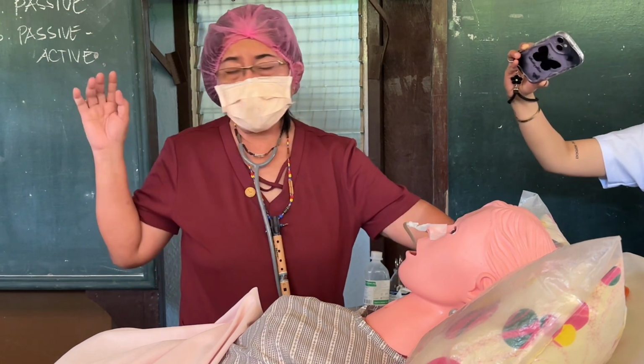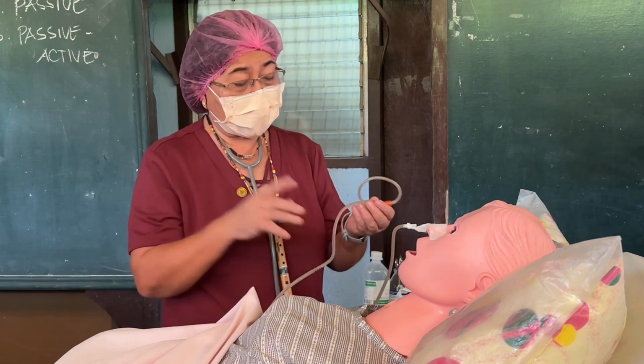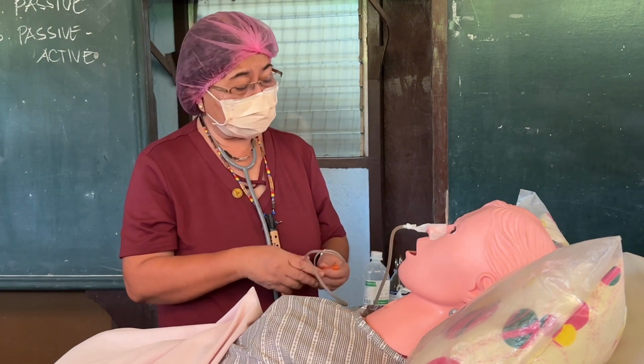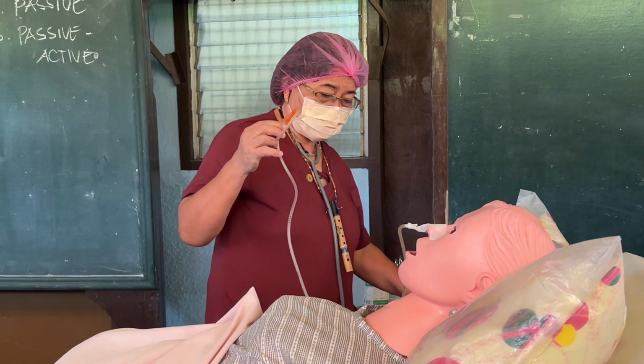Then there are others who just put it under the pillow. But others, their technique is like this.